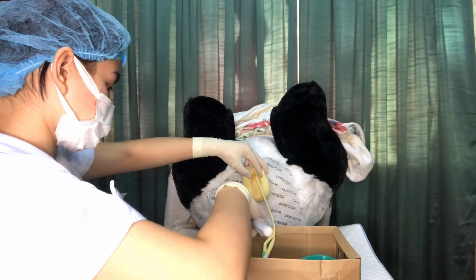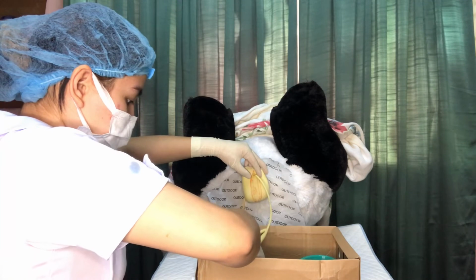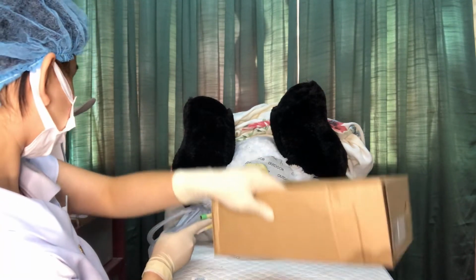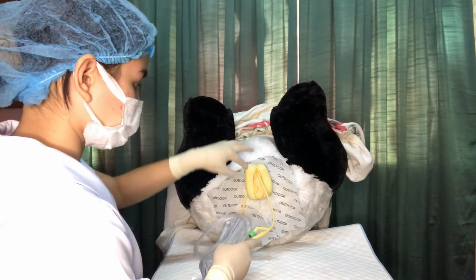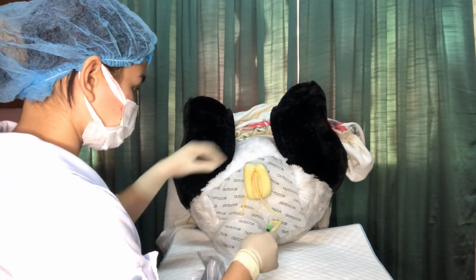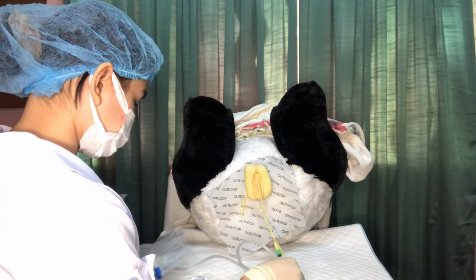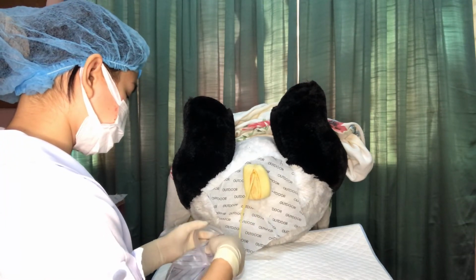You can check if it was inserted properly by shaking it a little bit, and if the Foley catheter does not fall off, then it was properly inserted.